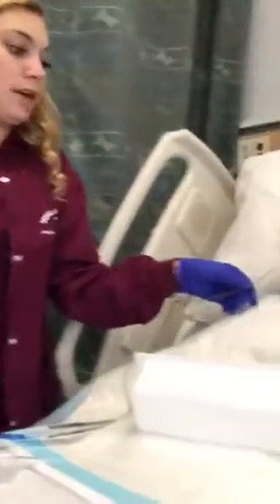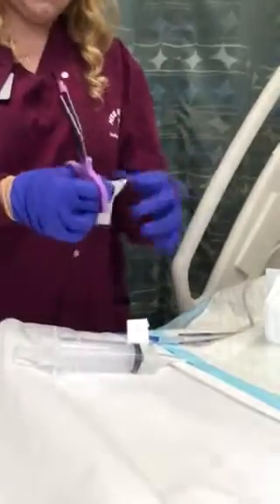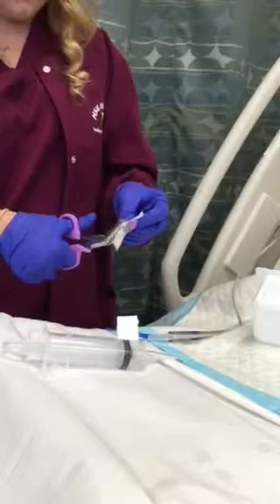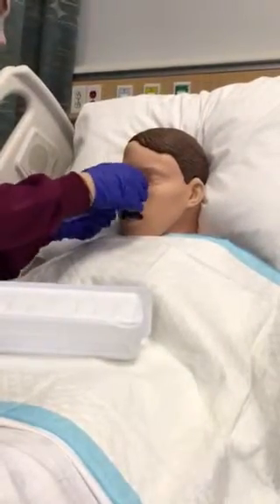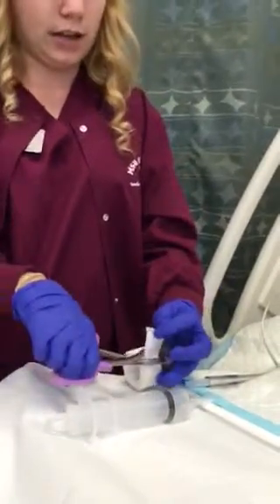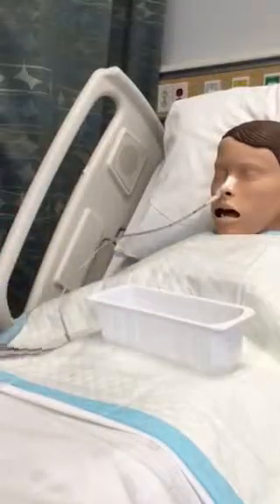Now I'm going to tape it to secure it. I'm going to rip 2 pieces of tape. You're all good. Okay. Put 1 piece of tape right here. It's going to wrap around, a little bit lower, and then wrap around. And I'm going to fold the edges so it's easy to undo. And then my next piece of tape I'm just going to put right over the bridge of the nose, which I cleaned before this whole process. So just like that.